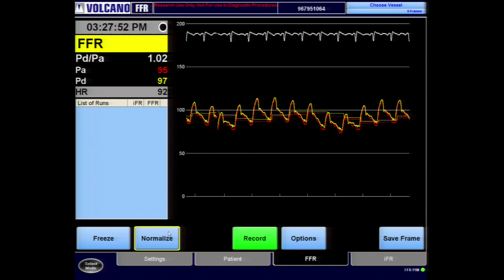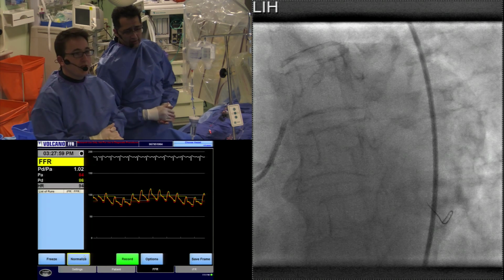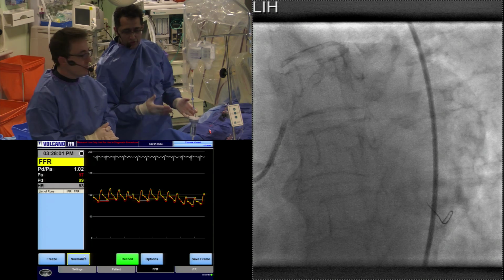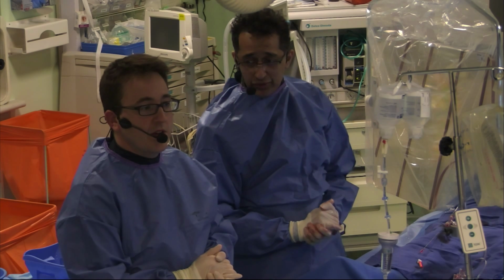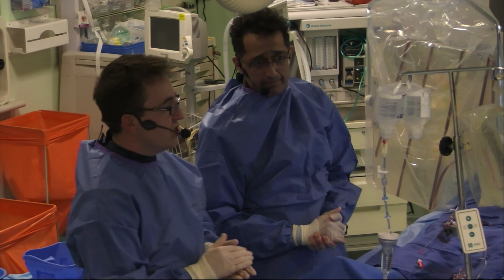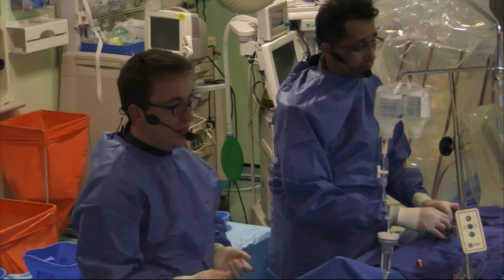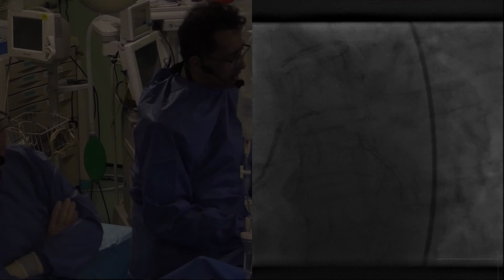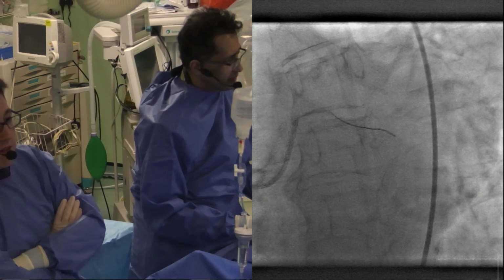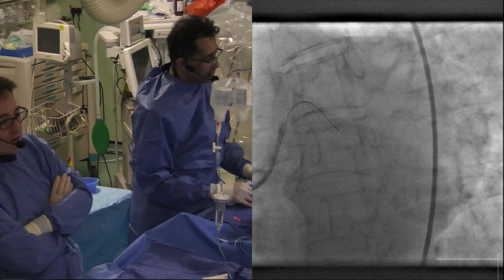Now in these cases you can see the chance of this becoming positive is almost zero. It's zero. I think it's always worthwhile to pull back and make sure that the pressures are fine at the ostium again. And I think that's what I would do next, unless there's something else that we want to do. I think we should do that, but let's just flush when we get back. Let's just check the pressure drift first, and then we can flush it and see. So we're going to pull this wire back and put it back into the left main stem, which is where we centered before. And there we are. We're in the mouth of the main stem again now.